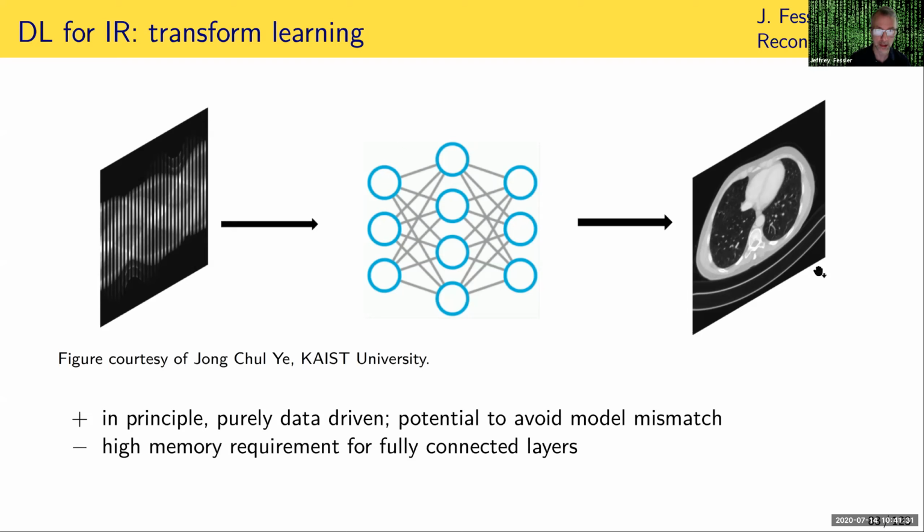So you typically need some stages at least that are fully connected, which are very large. And you're trying to basically learn the physics. They might argue otherwise, but you're essentially trying to learn the Fourier transform there. And so people who have worked on this in those various modalities typically have been limited to 2D modest size images, and it's pretty difficult to generalize this to 3D images of sizes of greatest interest.